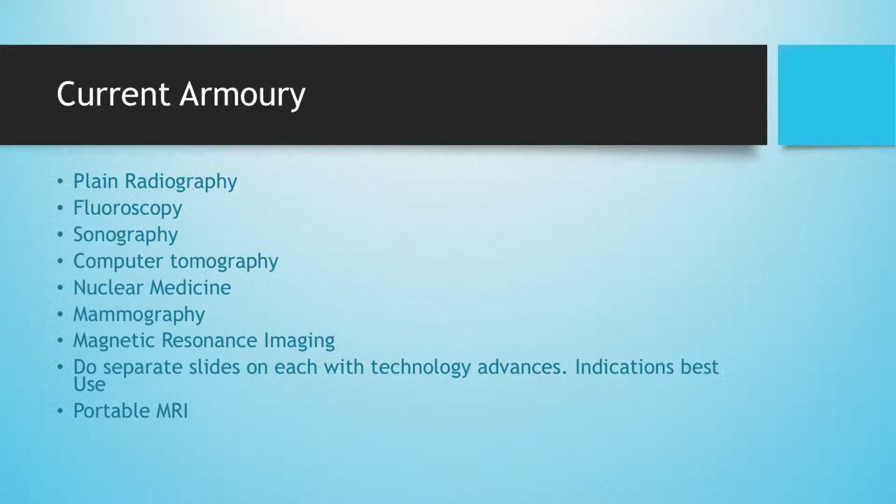The manufacturers claim that on planet Earth, it's roughly 10% of the population that has access to MR. I'm not sure if this is an underestimate, but the point is, there are a lot and lot of persons who would never have access to an MR because it's just too expensive. This will make the modality a lot more available. It's not as versatile, of course, as the bigger magnets, but it can do certain things.